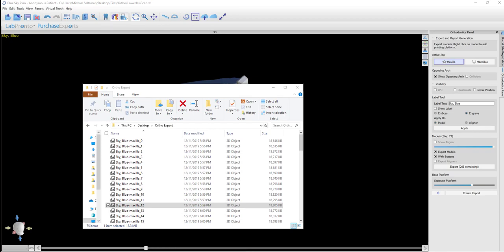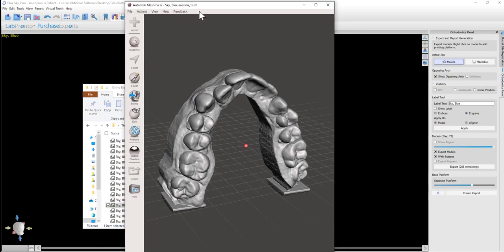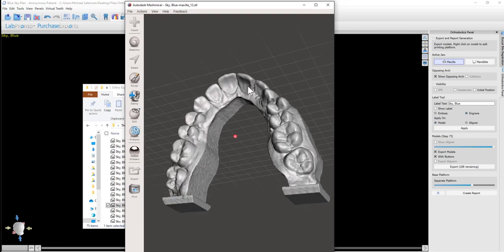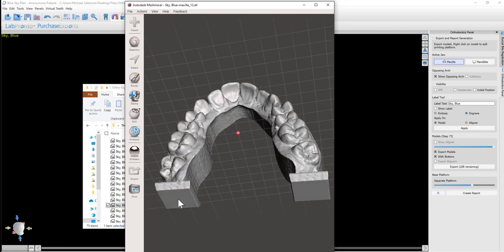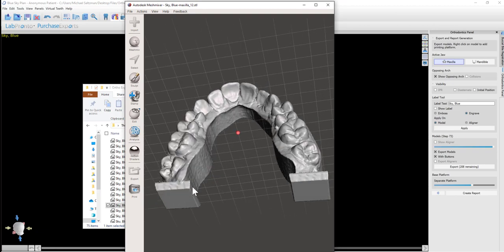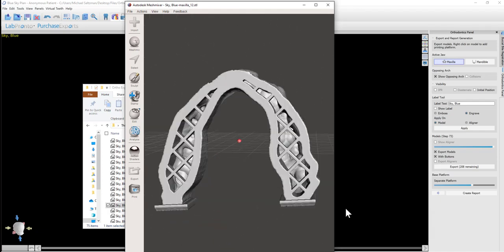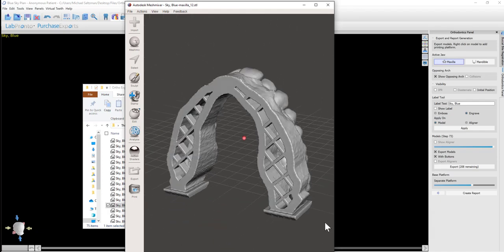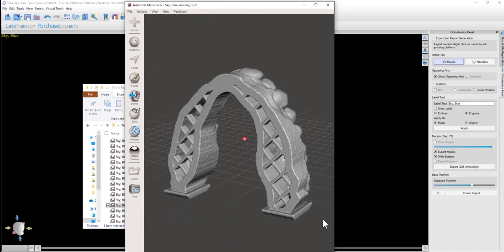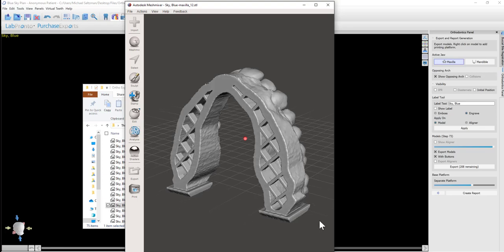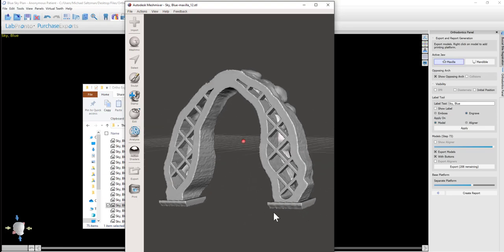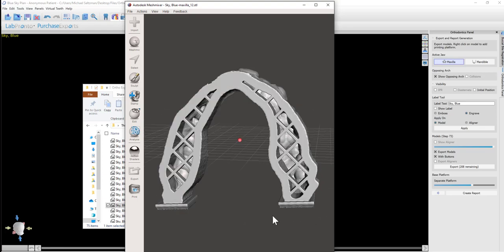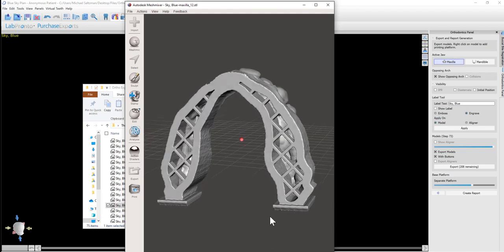The software exported all of our different models. If we go ahead and open one of them up, we could see the model. We could see that it has the platform for vertical printing. We could see that the models are printed hollow. This is actually an option in properties that can be turned off by default if you like, but by default the models are printed hollow to save on print material and print time.